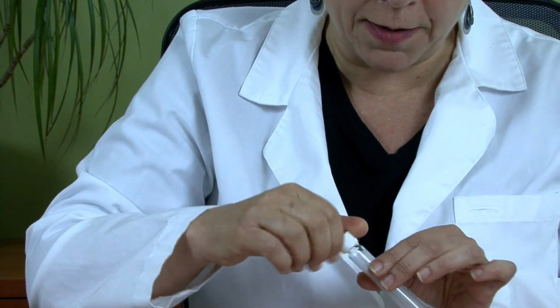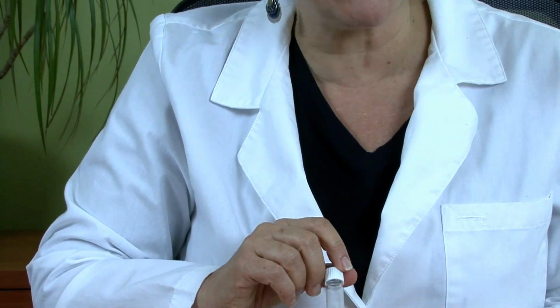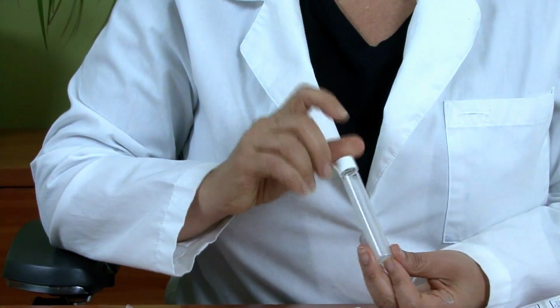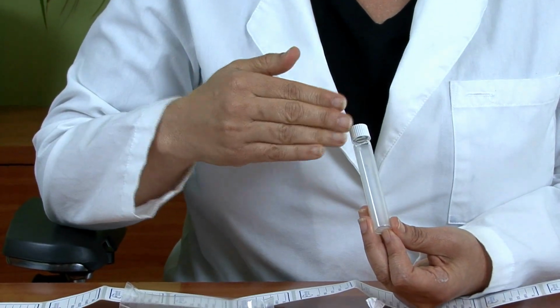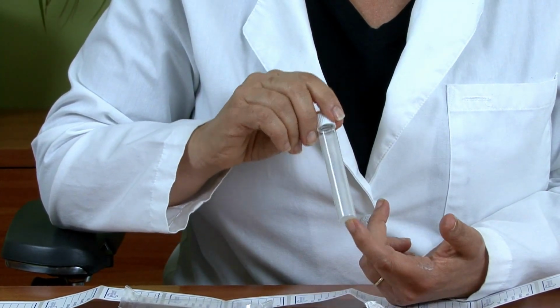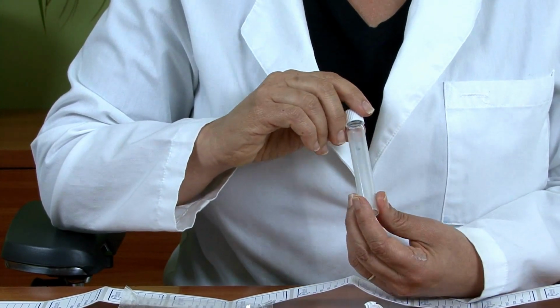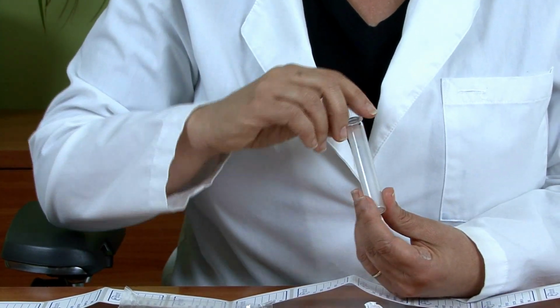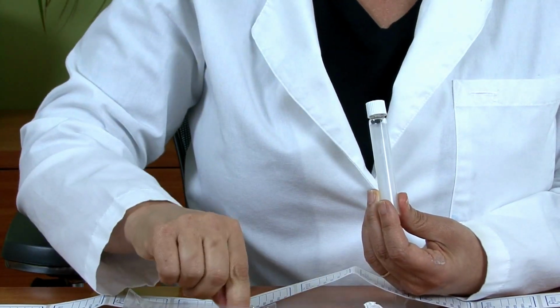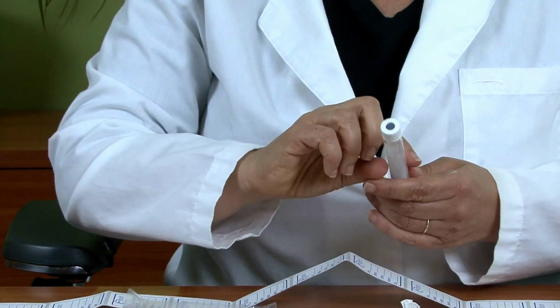Immediately put the cap back on. Okay, now what you've noticed is I had the straw completely down at the bottom of the tube, and I completely exhaled normally, a complete breath into the tube, and you will notice condensation on the sides of the tube. That is what we're looking for, and in fact the tube is actually warm from my breath. So I've capped it back up. Now don't throw this straw away. You're going to use it throughout the whole test. I'm going to go ahead and put my label on.